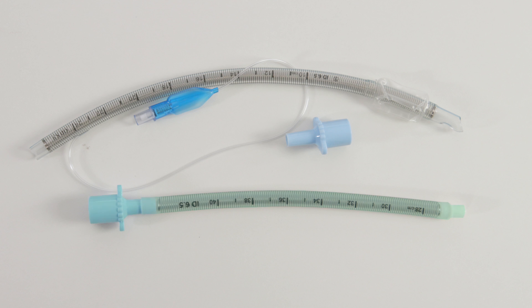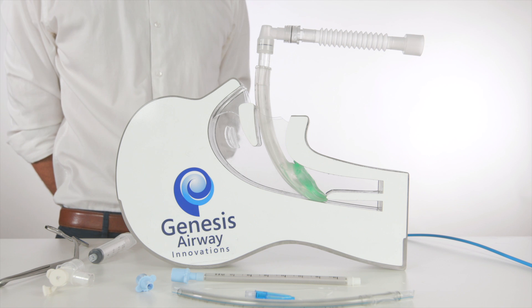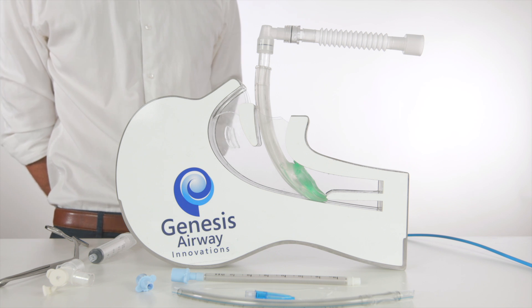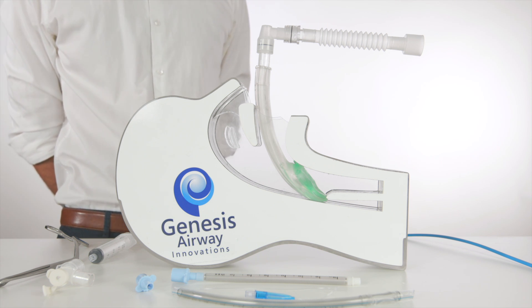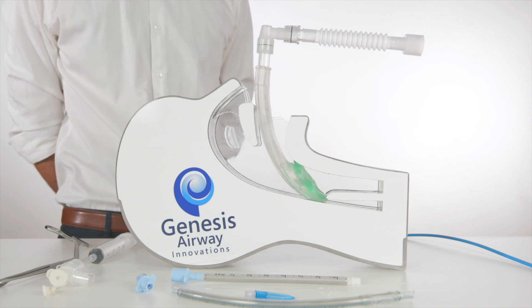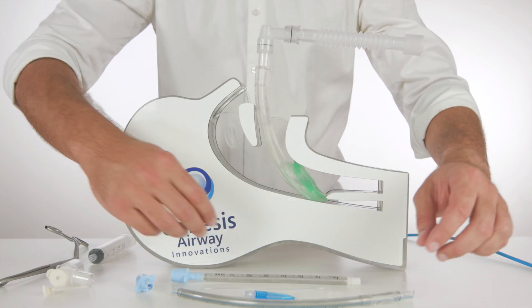There is also an airway tubing having a fixed 15mm ISO connector at the proximal end and a connector to mate with the distal end of the endotracheal tube. We have a patient with an airway currently being maintained with a laryngeal mask, in this case an iGel size 4. In the instance that endotracheal intubation becomes necessary, we can utilise this technique to secure an airway prior to the removal of an LMA.